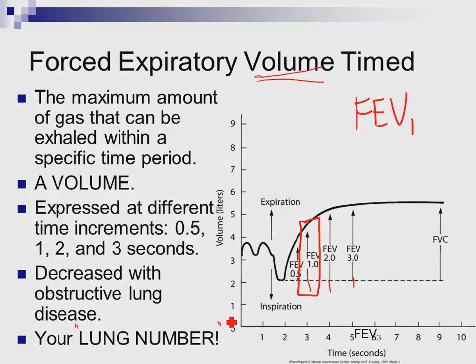But getting back to my FEV1, that's the value we're going to pay close attention to. The volume of gas that you can exhale forcefully in 1 second. Okay, but we can look at other points, half a second, 2 seconds, etc. But it's the FEV1 we typically look at.